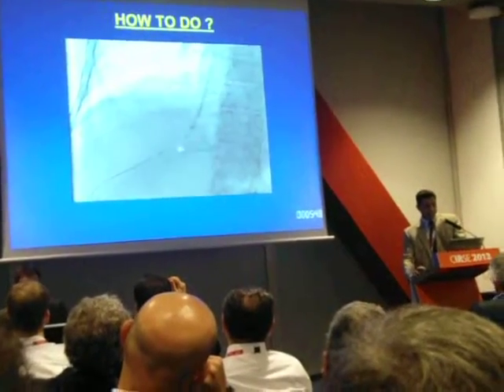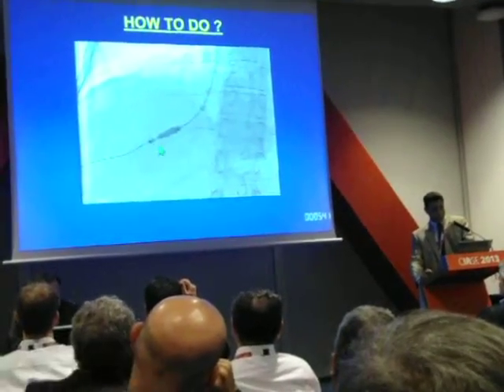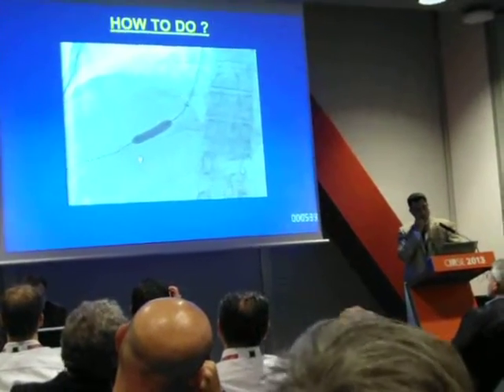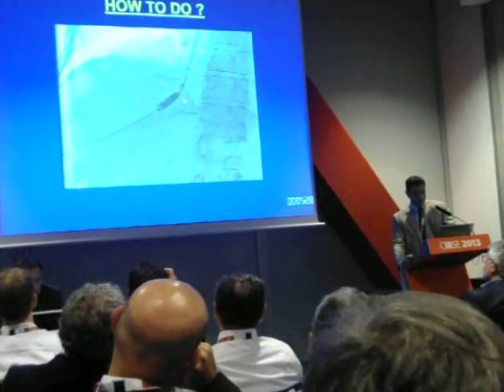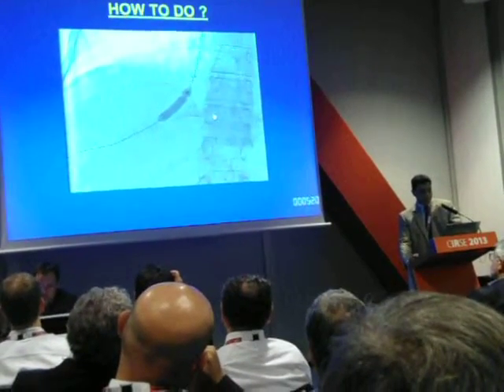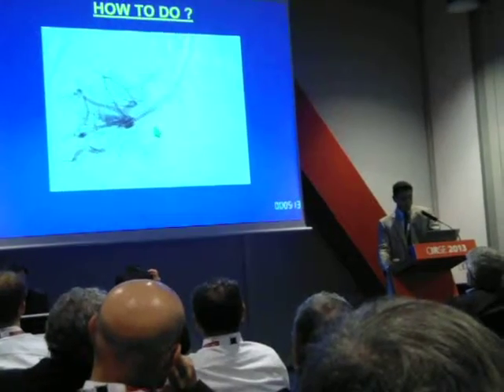After that, we dilate the track between the IVC and portal vein with an 8 mm balloon. We dilate first at the side of the portal vein. This is the waist at the portal vein wall towards the IVC, and we should be cautious to dilate only one wall, not both walls. Then we pull the balloon up to dilate at the side of the IVC. This is the waist at the IVC wall. Then the balloon is completely inflated. So the tract is dilated and we advance the sheath down to the right portal branch and do portography.